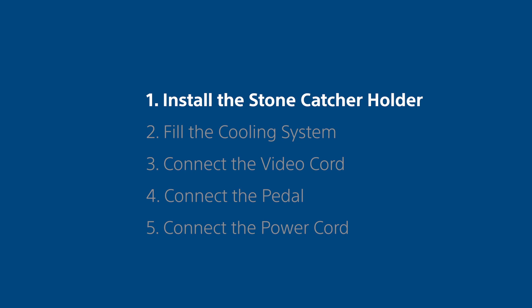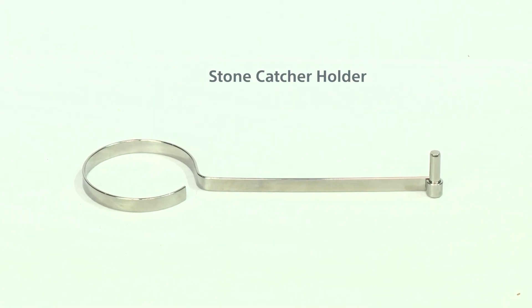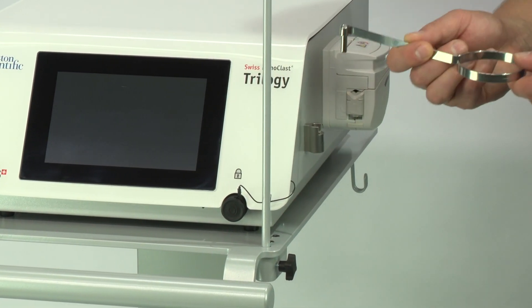Step 1. Install the stone catcher holder. Insert the stone catcher holder in the dedicated space on the side of the unit.